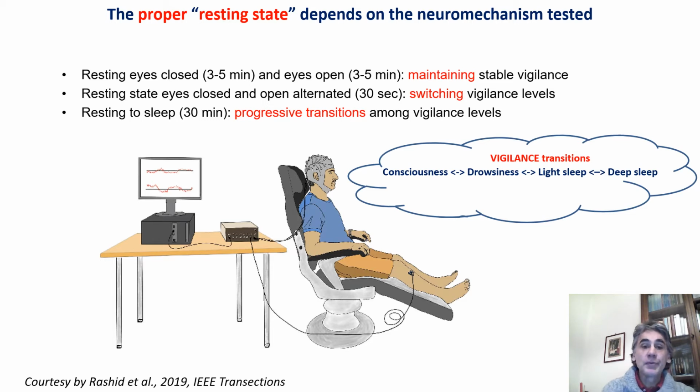The work group suggested that the proper resting state condition may depend on the neurophysiological mechanisms tested in clinical neurophysiology.